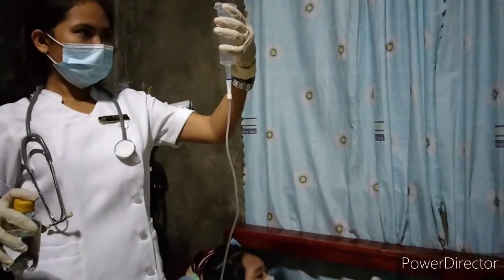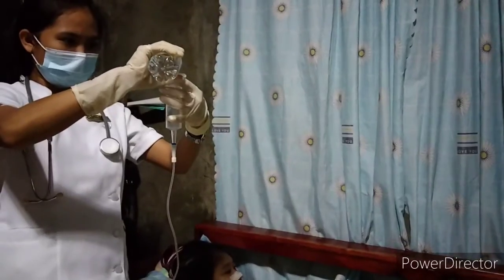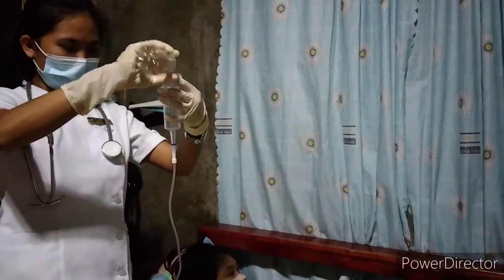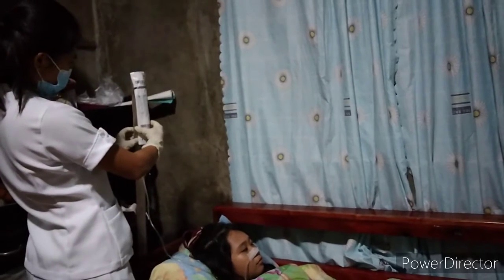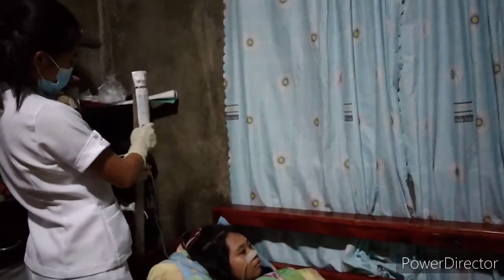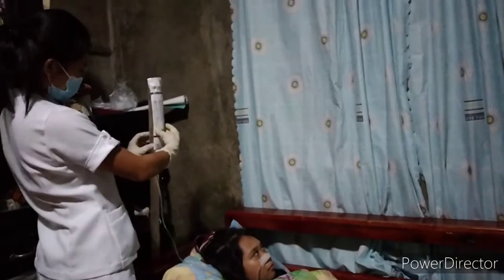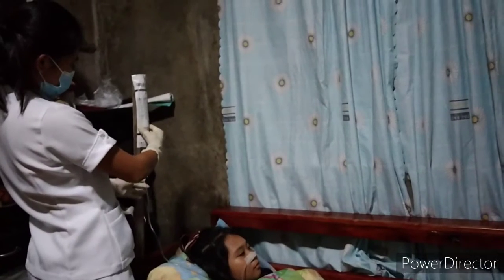If a feeding bag is used, hang feeding bag on an IV pole. Fill bag with prescribed amount of formula and allow bag to empty gradually over at least 30 minutes. Gradual emptying of tube feeding by gravity from syringe or feeding bag reduces risk of abdominal discomfort, vomiting, or diarrhea induced by bolus or too rapid infusion of tube feedings.